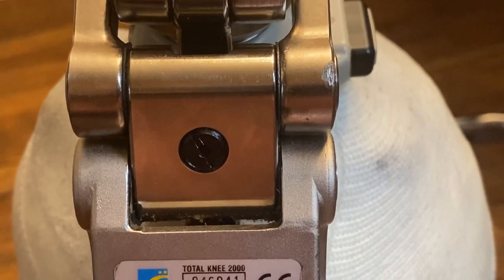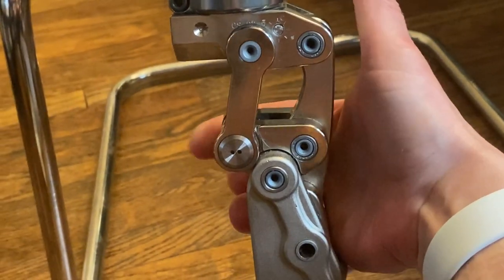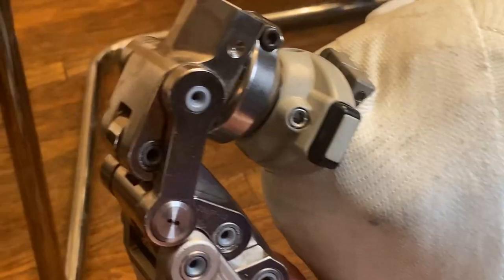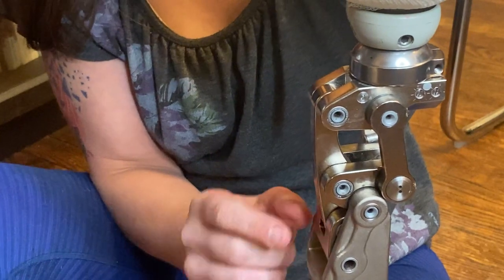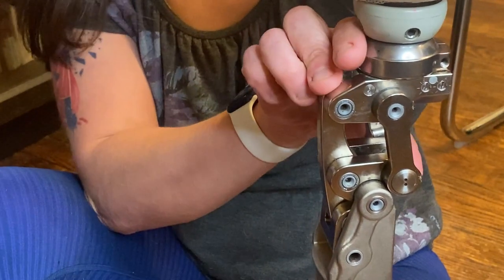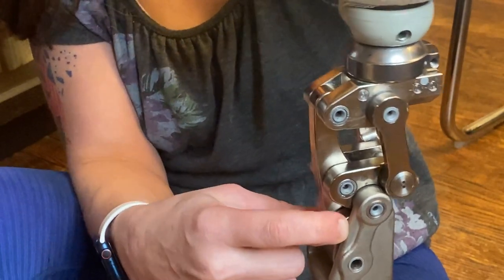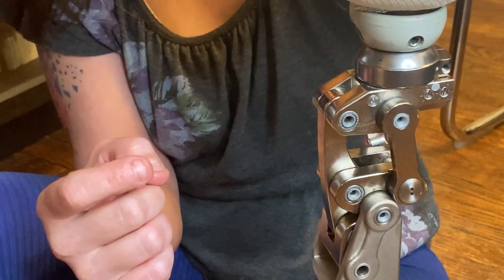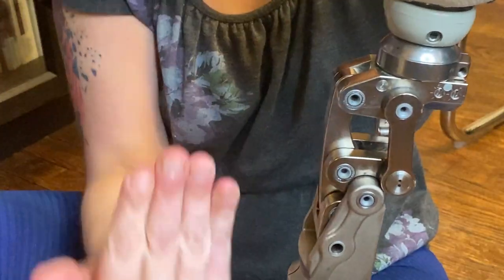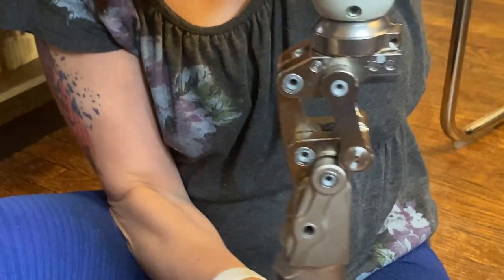I don't remember exactly what that one does either — I'll have to look it up. And there's the bumper. You can also get it to flex by squeezing here and here. Just hit myself in the shin. So it's locked in place unless this joint here is up this way. See right here — it's locked into place, that's stance. But then if you put weight on the toe, it allows it to bend here. So it's stuck in place, and then it bends. Hopefully that makes sense.